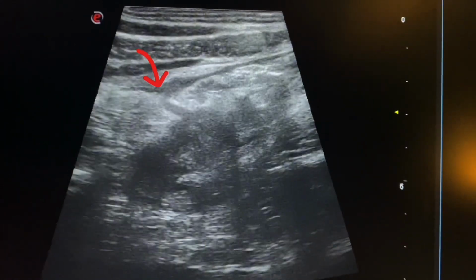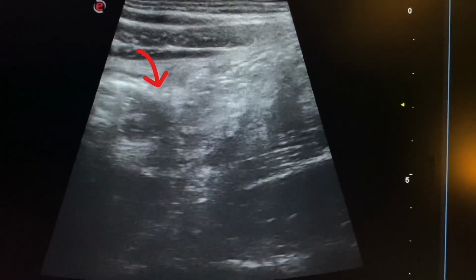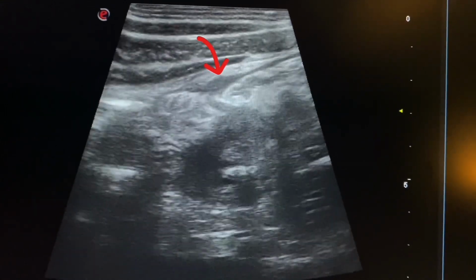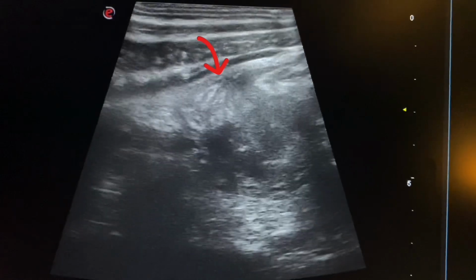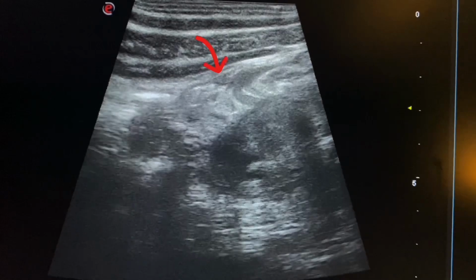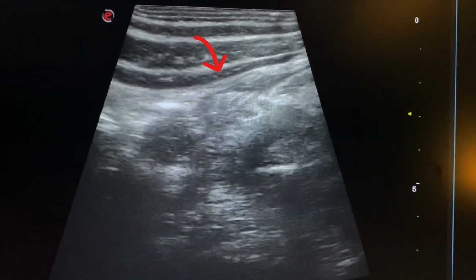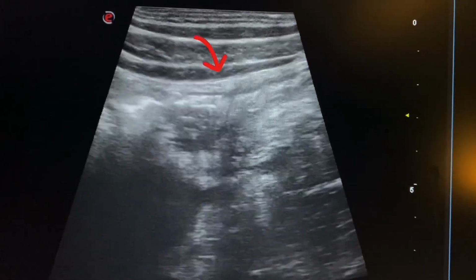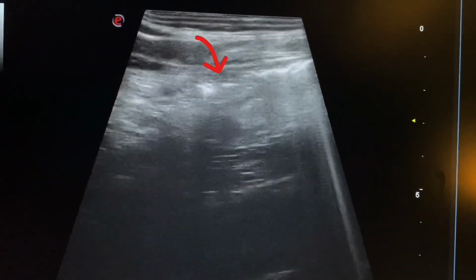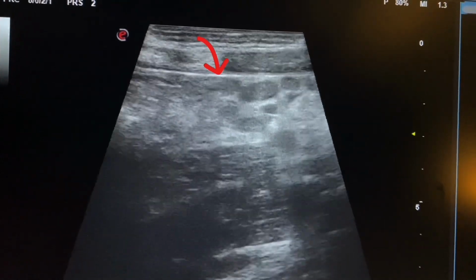Here we also see gases, but the walls of cecum are prominent, seen as a hypoechoic line and an internal echogenic line. The hypoechoic lining in the walls of intestines are muscle layers, and these echogenic linings are submucosal layer, which are normally not visualized, but when there is inflammation they become thickened and visualized.